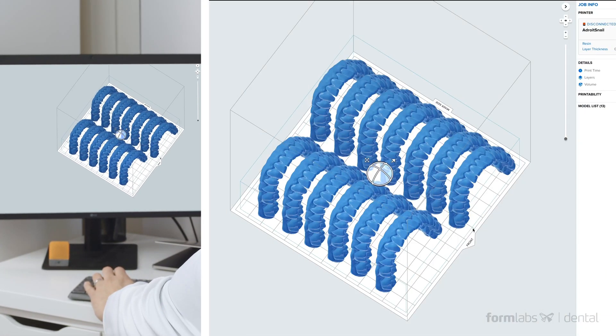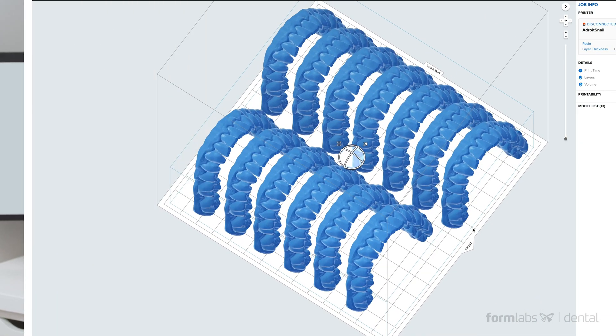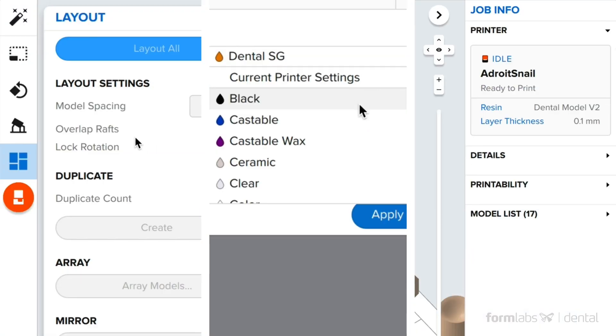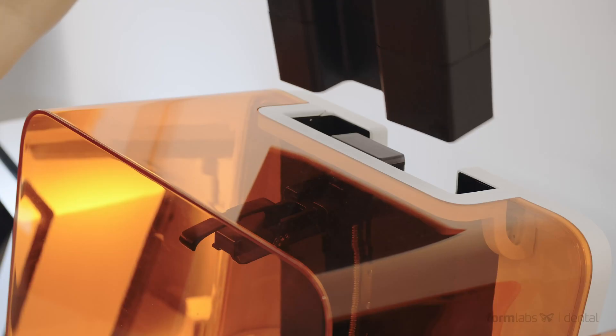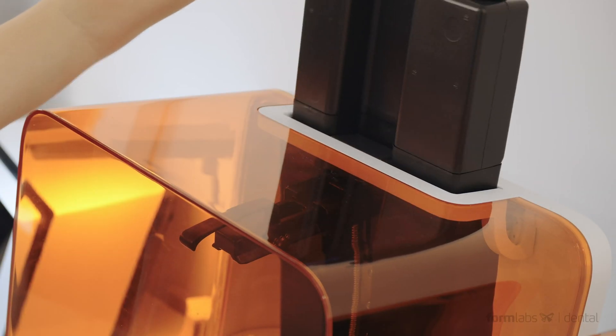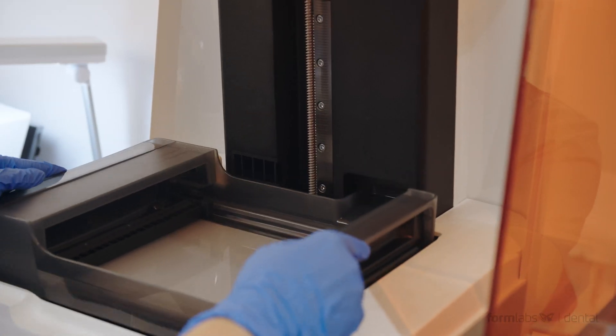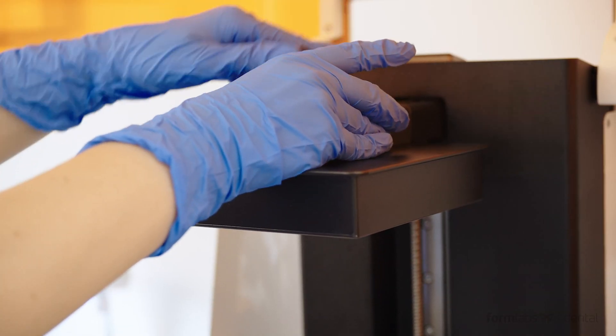With user-friendly preform print preparation software that integrates seamlessly with existing imaging and CAD-CAM solutions, an automatic resin dispensing material cartridge system, and a carefully integrated end-to-end workflow.